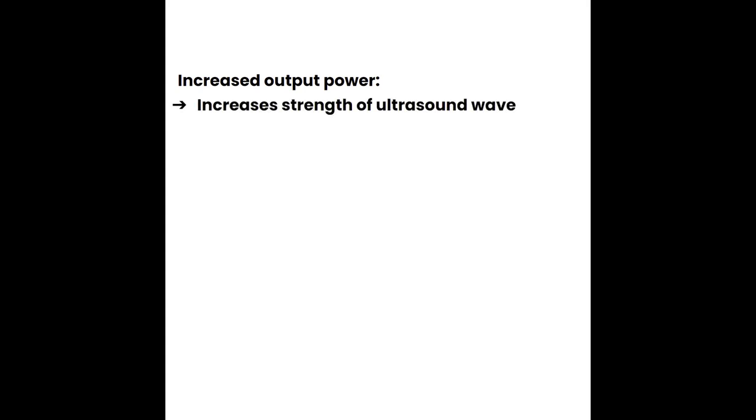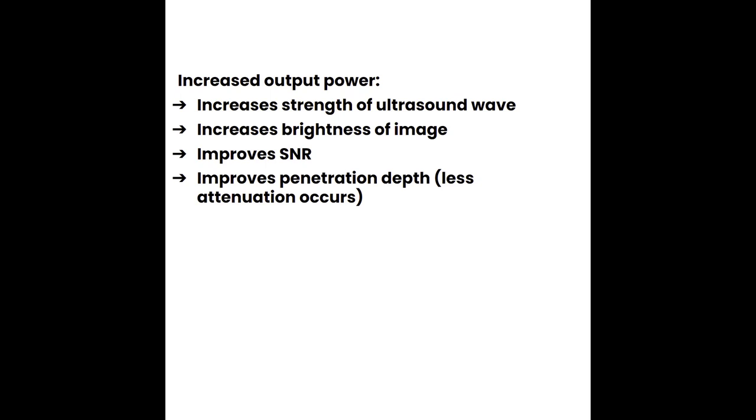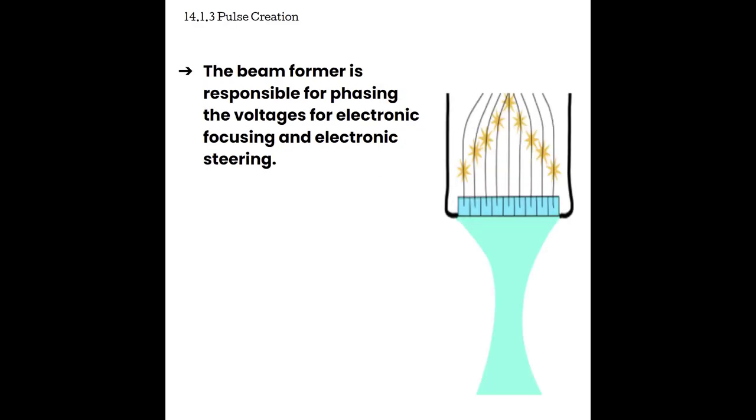So remember, with increased output power, what we are going to see is an increase in the strength of the ultrasound wave, which increases the brightness of our image. It improves our SNR, or signal to noise ratio. It's also going to improve our penetration depth because less attenuation is going to occur, but it increases risks of bioeffects.